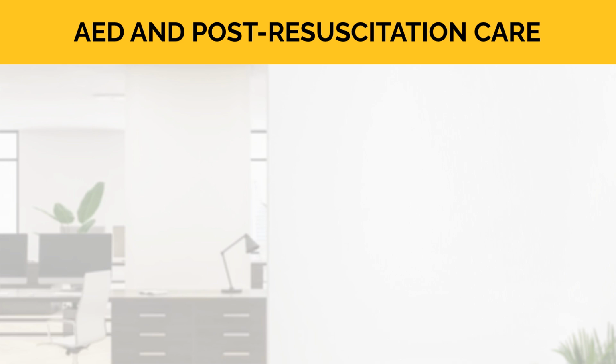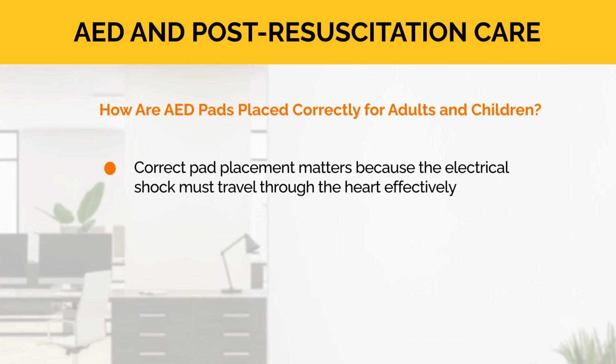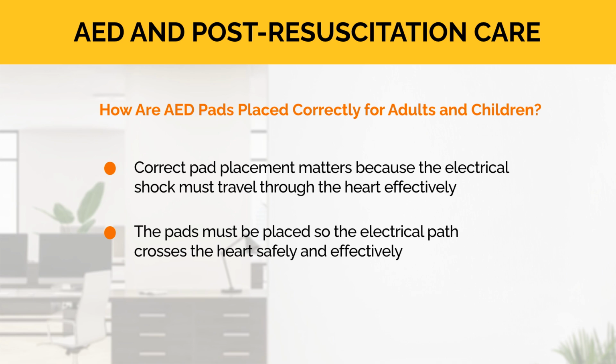Now let's get started. How are AED pads placed correctly for adults and children? Correct pad placement matters because the electrical shock must travel through the heart effectively. The pads must be placed so the electrical path crosses the heart safely and effectively.